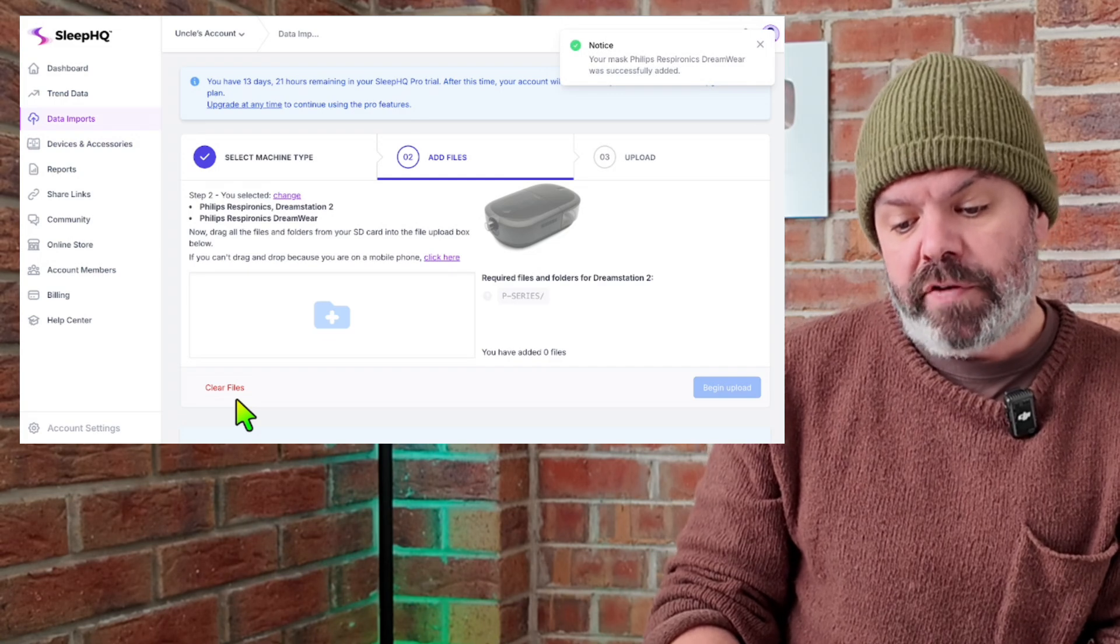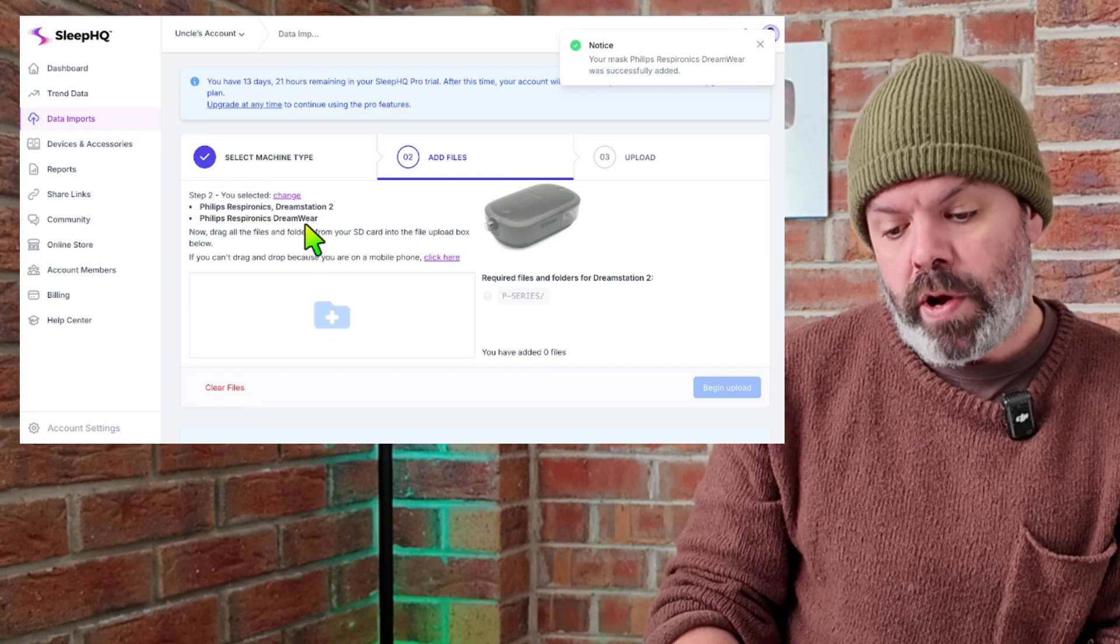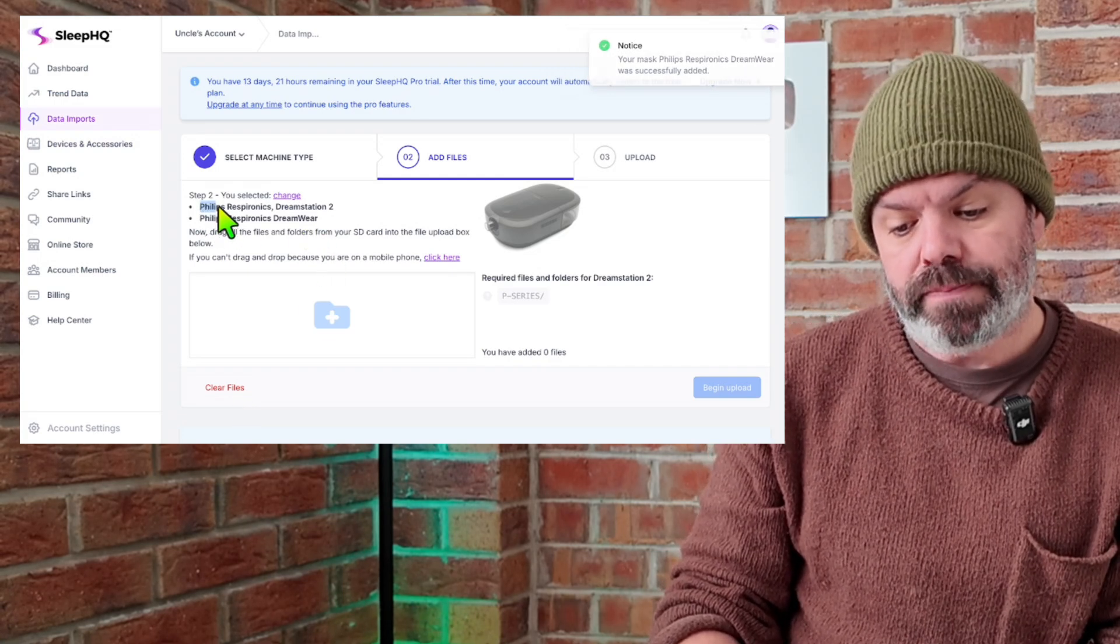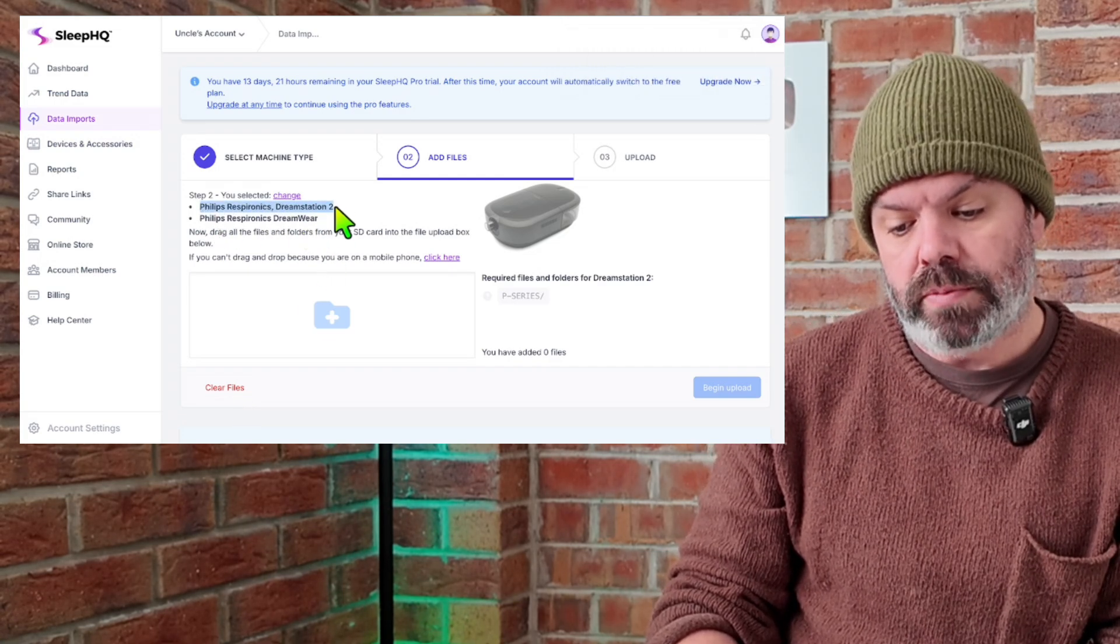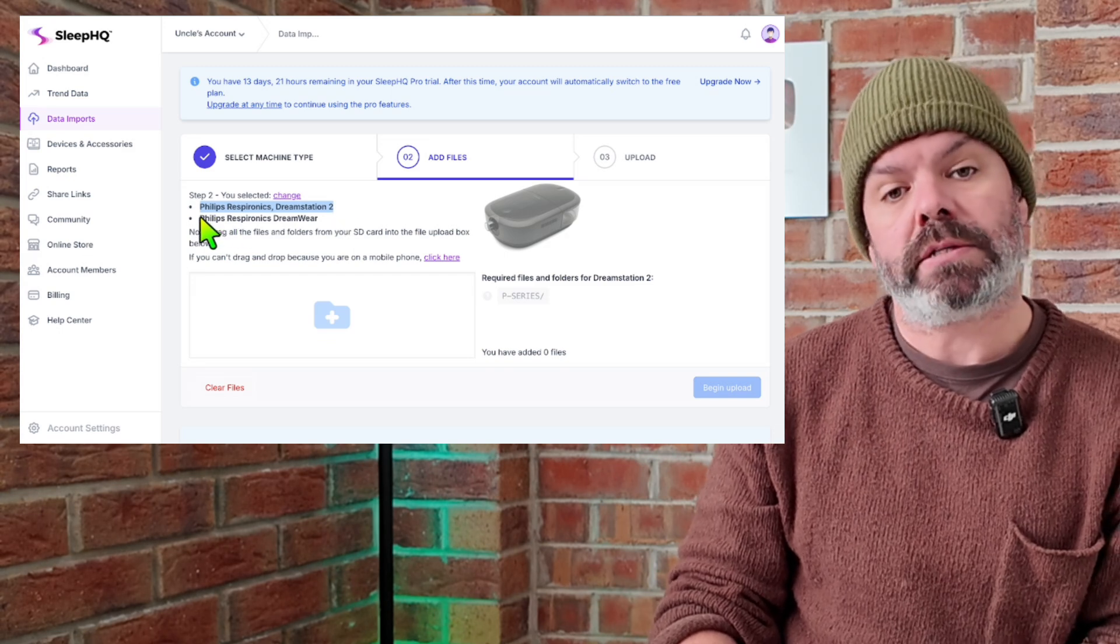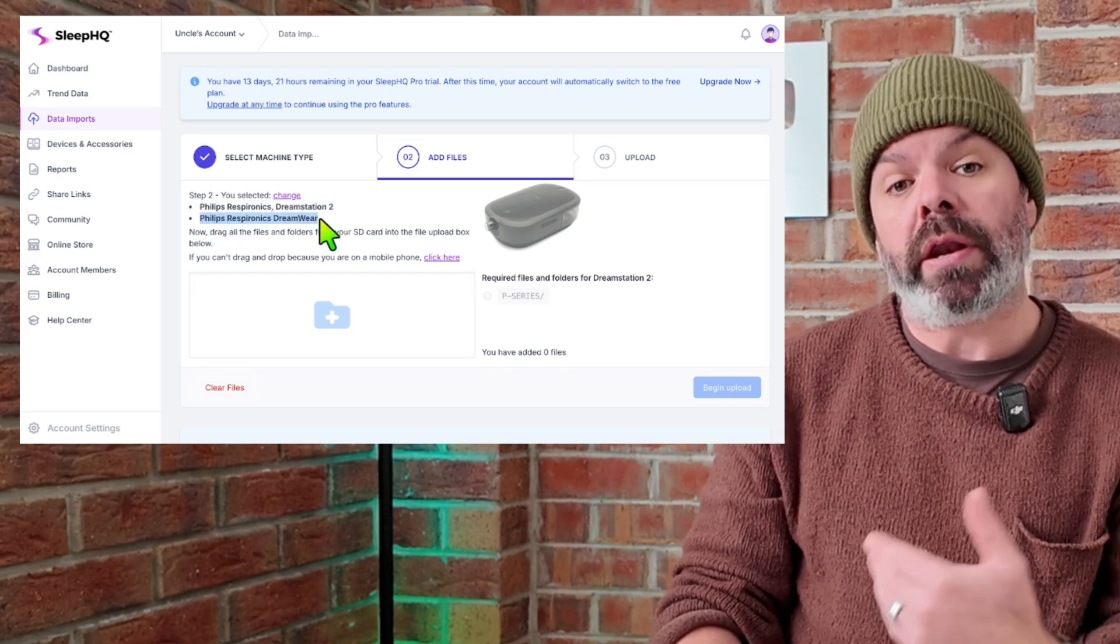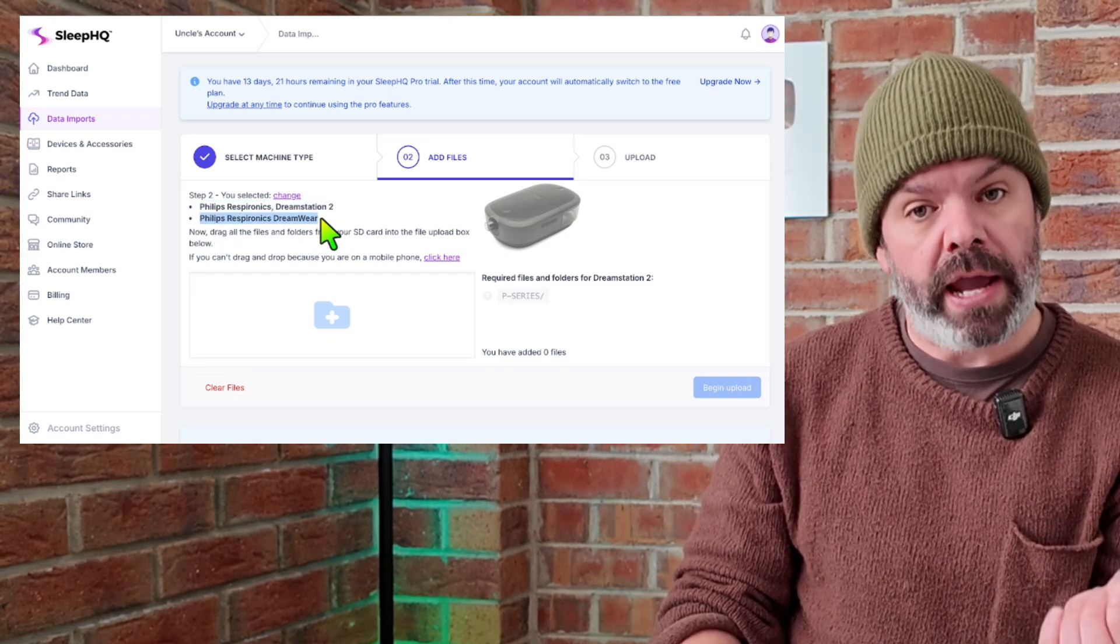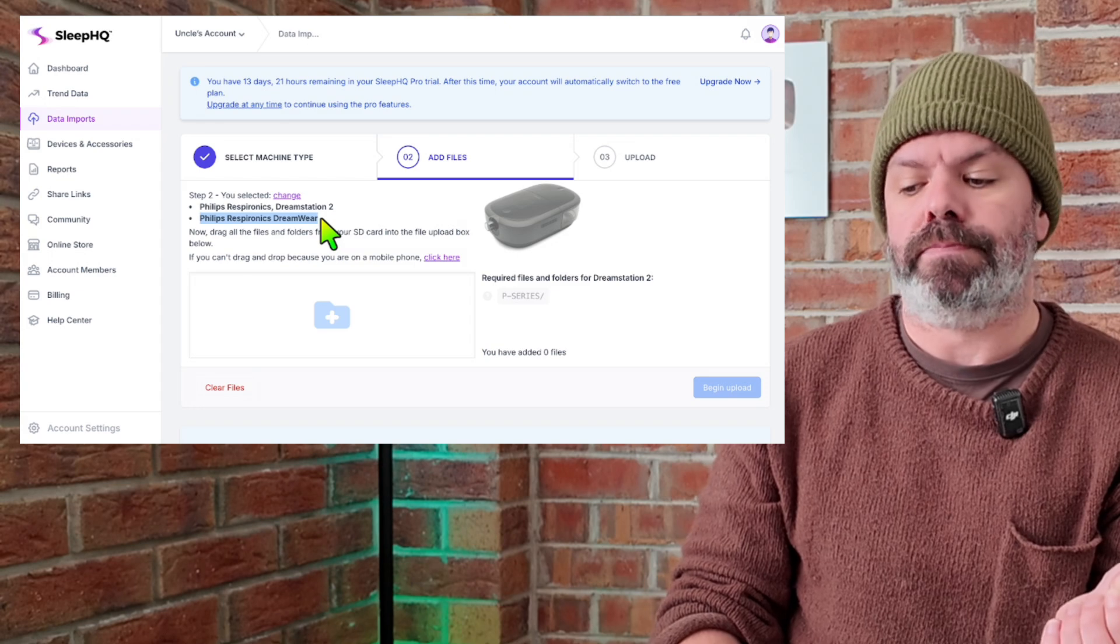So now we have our Philips DreamWare, DreamStation 2 here with our Philips Respironics DreamWare mask. And now we're going to import the files and it's a drag and drop method.